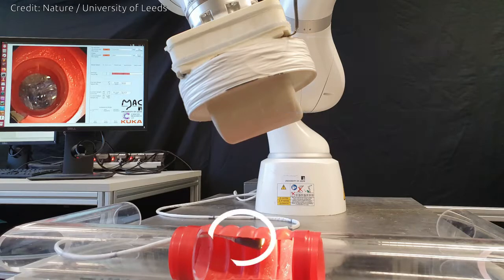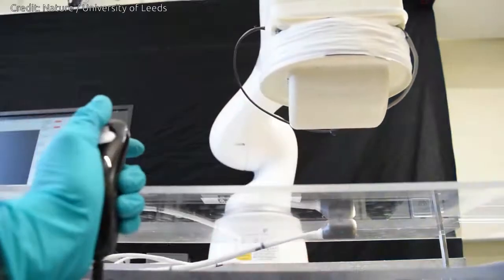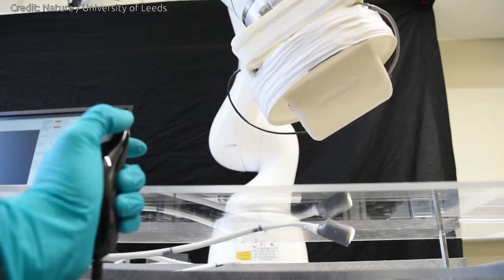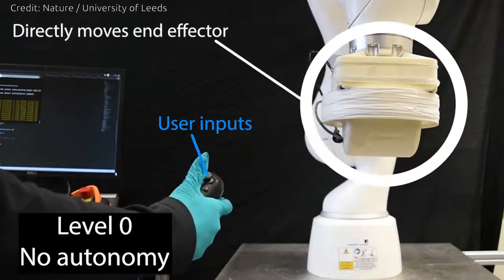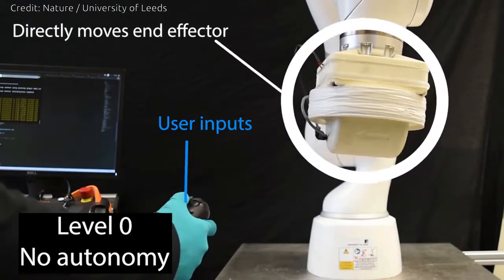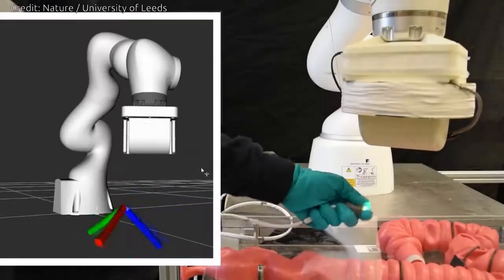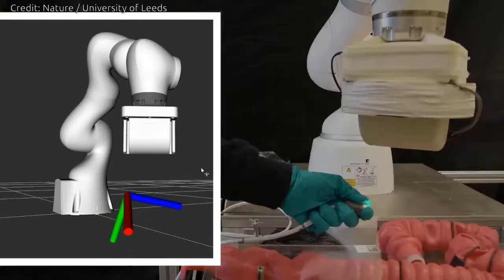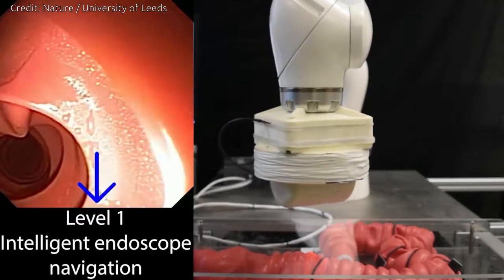Colonoscopy gives doctors a window into the world hidden deep inside the human body, and it provides a vital role in the screening of diseases such as colorectal cancer. But the technology has remained relatively unchanged for decades. What the researchers have developed is a system that is easier for doctors or nurses to operate and is less painful for patients. It marks an important step in the move to make colonoscopy much more widely available, essential if colorectal cancer is to be identified earlier.